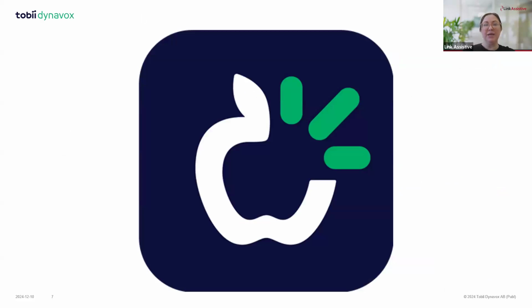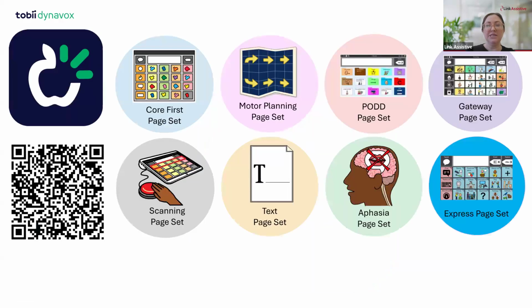So today, jumping straight into it now, we will be introducing you to the new TD Snap Express page set. But before we do, we thought we would quickly review TD Snap as a software overall. For anyone who is not yet aware, or as a reminder for those of you who are, TD Snap is an augmentative and alternative communication, or AAC, platform that uses a variety of different language systems, vocabularies, or what we would call page sets to meet a wide range of communication needs. Just as a reminder, TD Snap offers a suite of eye gaze, touch, and switch-enabled page sets to meet different communication needs and preferences.